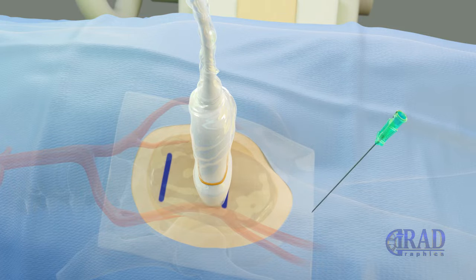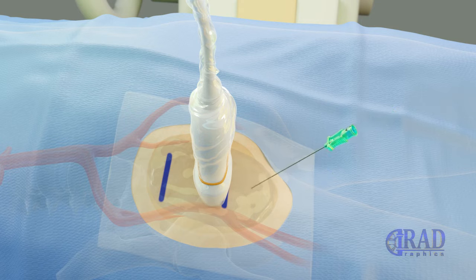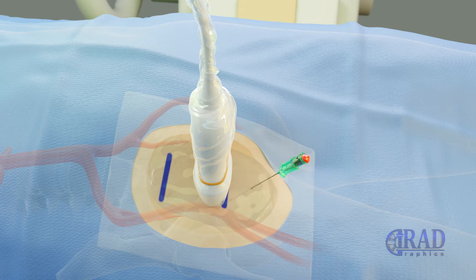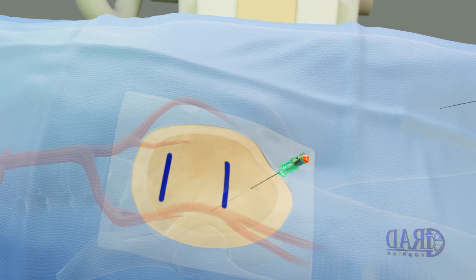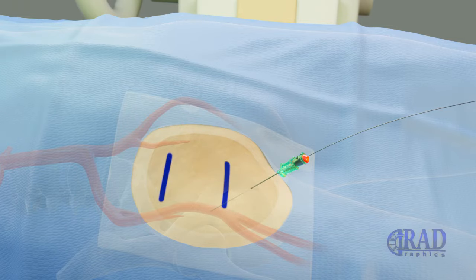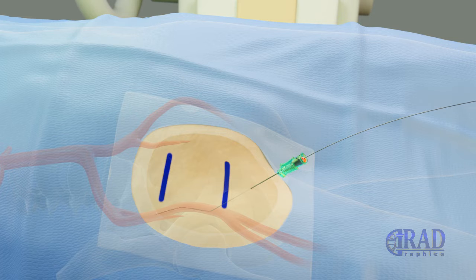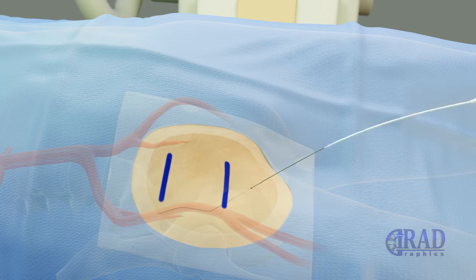Then, the right common femoral artery is accessed under ultrasound guidance using a micropuncture needle. Once blood return is noted, a microwire is advanced through the needle into the right common femoral artery. Then, the needle is exchanged for a transitional sheath.